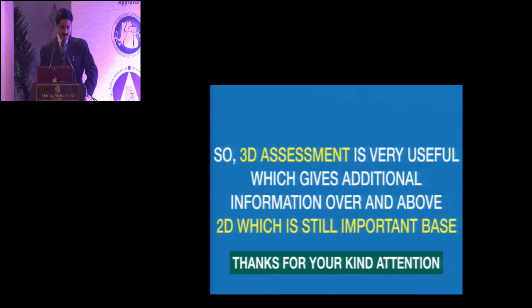So 3D assessment is very useful, which gives additional information over and above the 2D, which is still an important base. And I say again that before acquiring the 3D images, it is very important to have the best 2D images. Without that, it is not possible. Thank you very much for that.